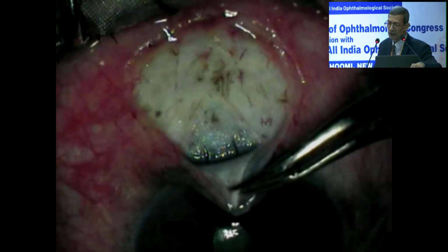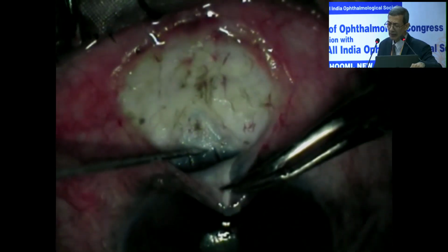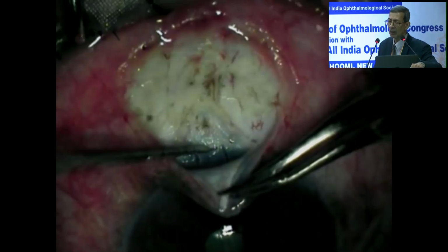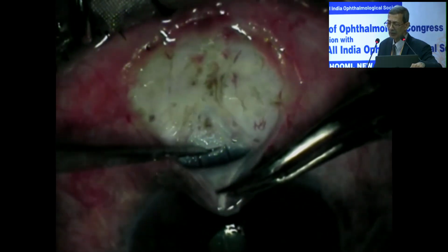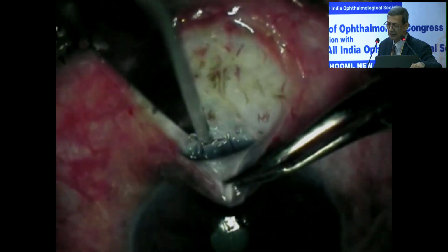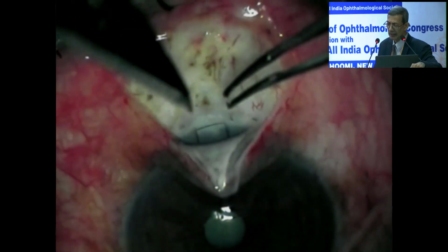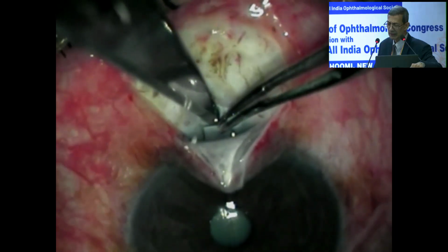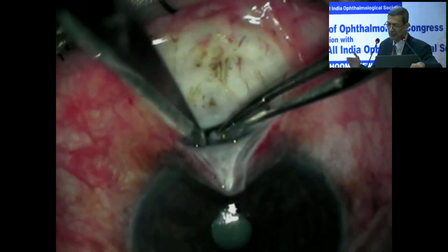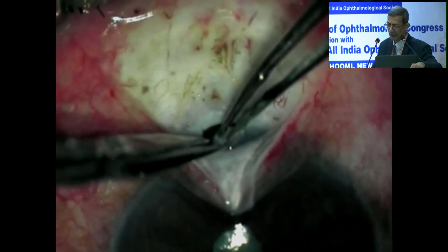The posterior incision will also be given, as you are seeing here, again a superficial incision just to delineate the area of subscleral tissue you want to remove. Then a very pointed entry is made just to make sure that the anterior chamber is entered, and you can see the blade has been reversed so that it is just inside the superficial wall.